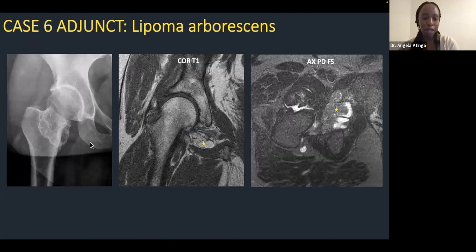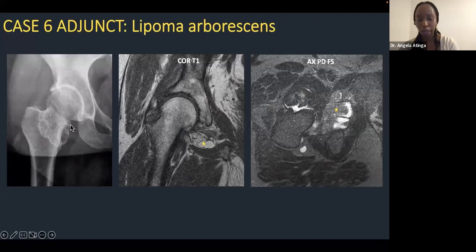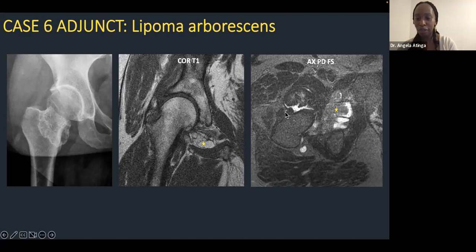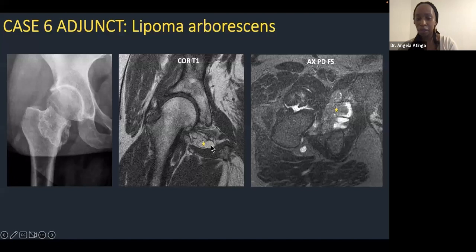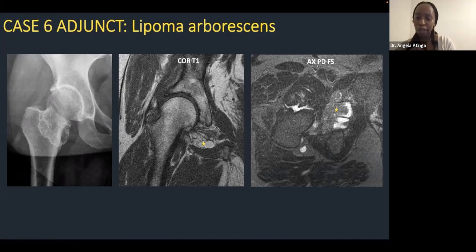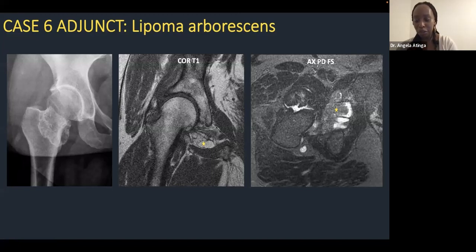Lipoma arborescens was a common choice here. This case presented with what appeared to be chondromatosis — mineralization projected over the femoral neck on X-ray. But on MRI this corresponded to one very large singular intra-articular body at the anterior aspect of the hip, possibly from childhood trauma, causing chronic synovial irritation. The result was fatty hypertrophy of the synovium: on T1 images the synovial hypertrophy is T1 bright, with saturation on PD fat-sat sequences. Lipoma arborescens is rare in the hip, much more common in the knee, and often occurs with chronic synovial irritation or pathology producing fatty hypertrophy.